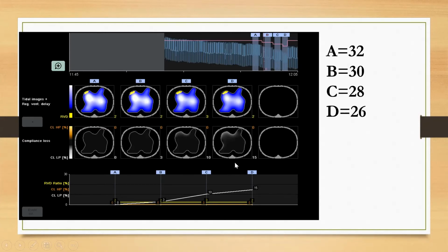Unfortunately, the template around this cannot be flipped around. So when you have a prone patient, you have to just remember that this is actually the patient's chest and this is their back, which is normal. This is where the lower PEEP, you would be losing the dorsal region. Look at another video. This one is a recruitment of the left dorsal region.